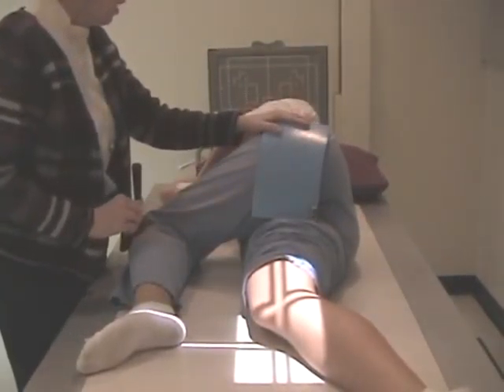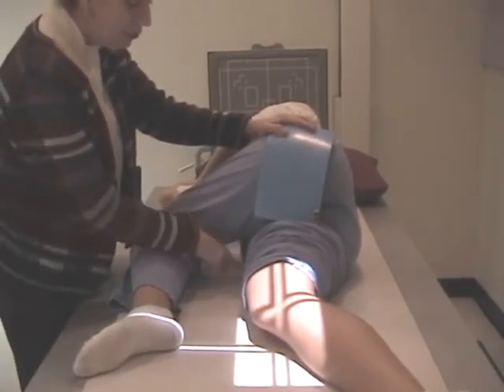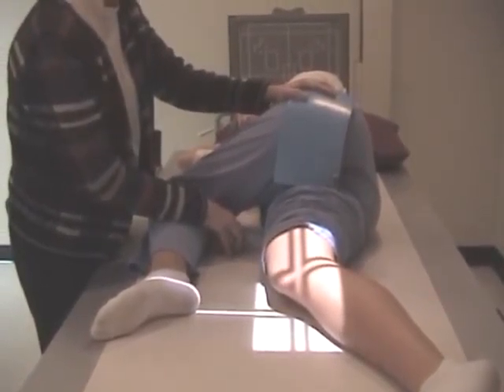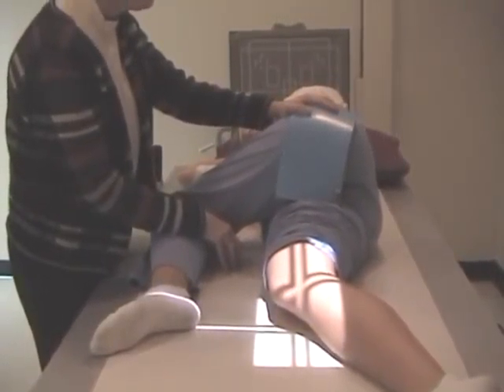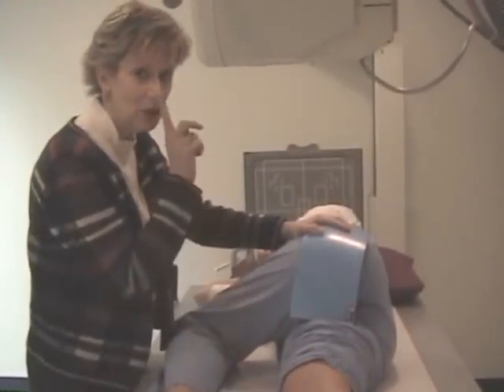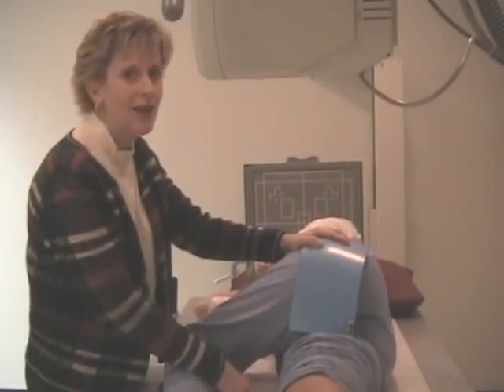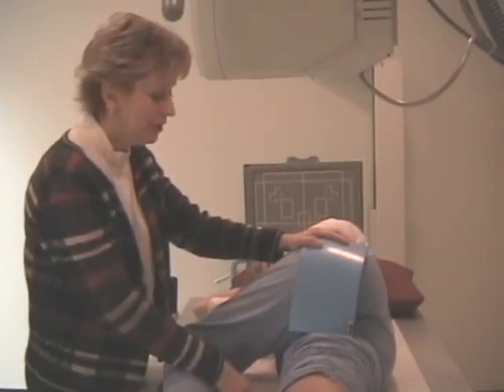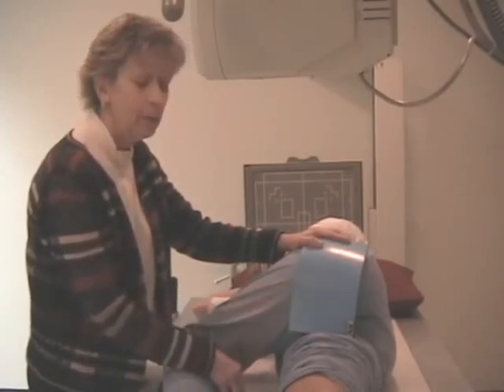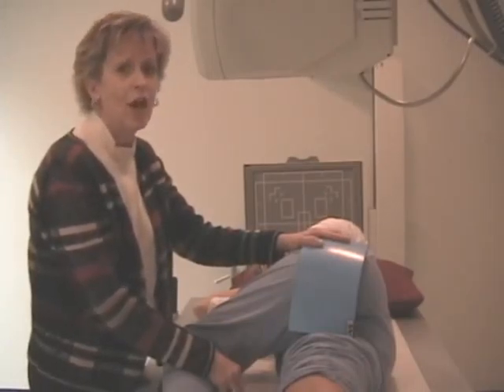Now you can also watch the patient's face, because if they're in a true lateral position, they're actually resting right on this lower trochanter and it's uncomfortable. So Kristen knows what I'm talking about, because I have her in a true lateral position now, and she's resting right on that trochanter. And when you practice this in the lab, you'll understand why we say it's not comfortable to be in this position. So watch your patients. You can ask them if they're resting right on that hip, and most of the time they'll let you know they are, or they'll look at you funny because it's not hurting.